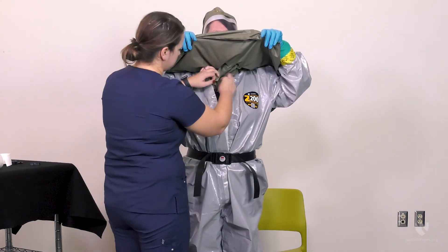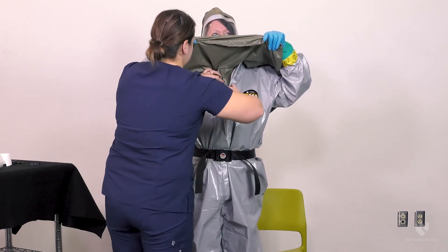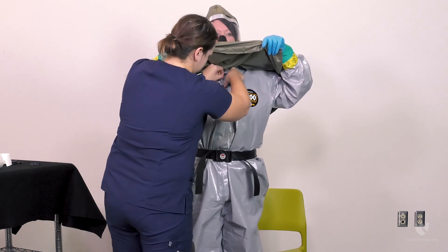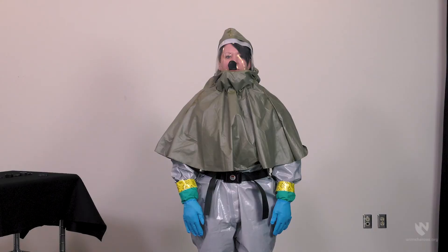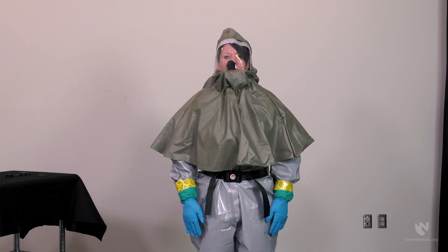Next, the zipper should be closed up to the neck and the flap taped shut. The outer shroud of the hood should then be placed over the shoulders. The support team should be aware of several hand signals that can be used to indicate distress while wearing the suit: patting the head indicates that the decon team member needs to get out of the suit, and putting hands at the neck signifies the inability to breathe. This concludes the donning process for Level C Chemical Personal Protective Equipment. Be sure to watch the video on doffing Level C 3M Chemical Personal Protective Equipment for the proper doffing procedures.